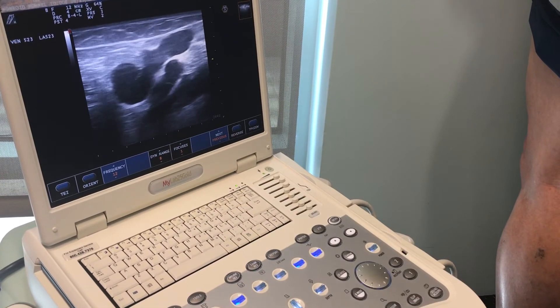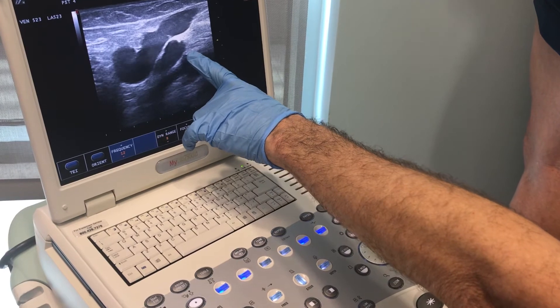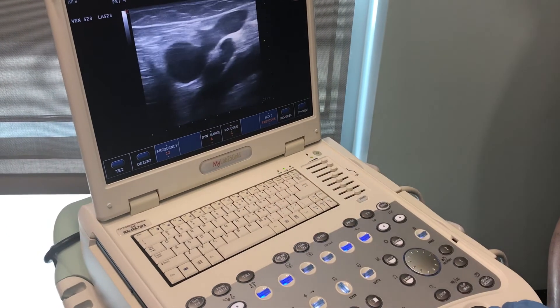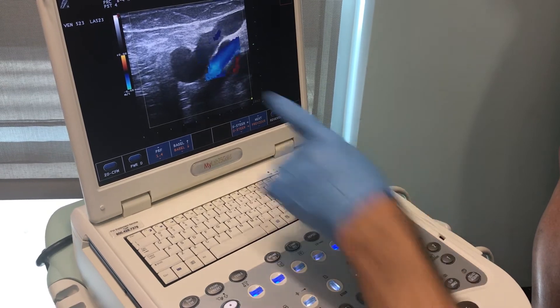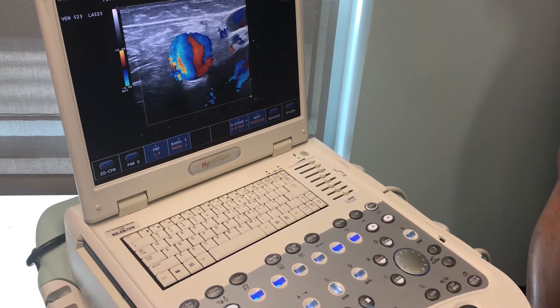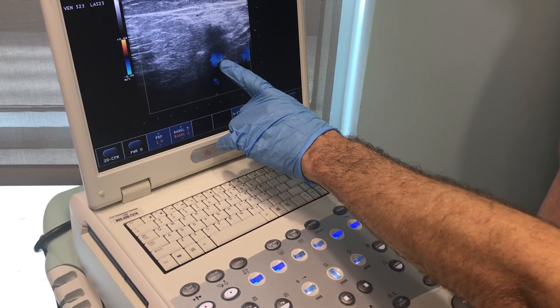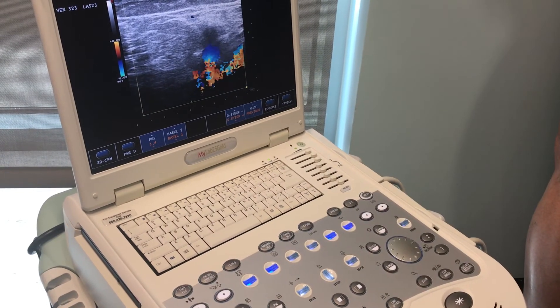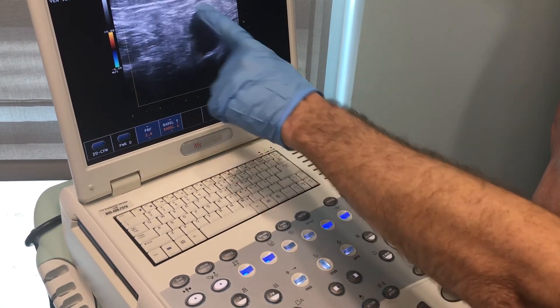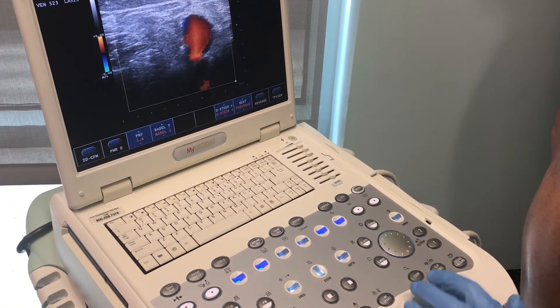There's a little curve right here, so I'm going to mark his leg. These are deep veins — you can see the blood going through these. As he breathes, it makes the blood go up and down. This little white thing here is a little valve; you can see it flopping around a little bit. I'm going to show you where the vein is broken — this is the vein we're going to treat. I'll do a little push and you'll see the backflow in this vein. This is where that vein goes into the deep popliteal vein. You can see almost like a jet, a red thing shooting back — that valve is pretty tight, so the blood is coming back and shooting through, creating this turbulence. You can see it right here — it looks like it's spitting fire back through that little hole.